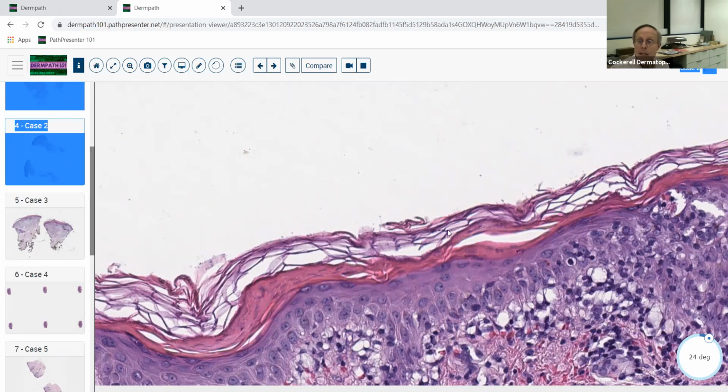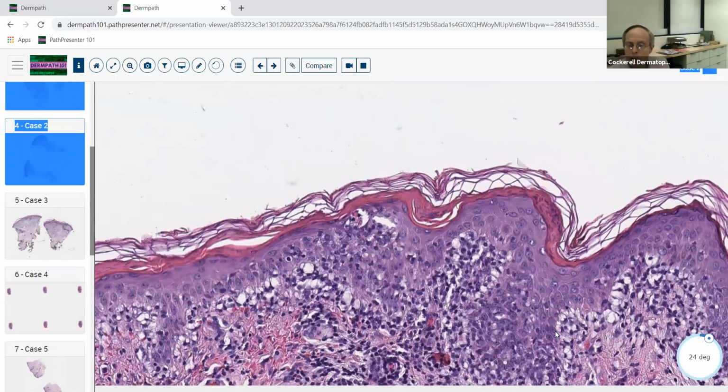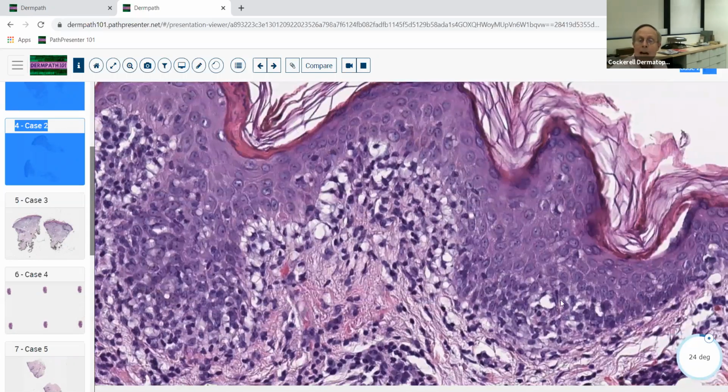We might have, in some cases, you'll actually get some neutrophils in here, maybe some neutrophils over here. And notice that it's kind of adherent and confluent over a broad front. Those are all important findings as well. If you look in the epidermis, you can see that there's also some diskeratotic keratinocytes in here. So I'll point a couple of those out. Maybe there's one right there. Maybe that one's dying over here.